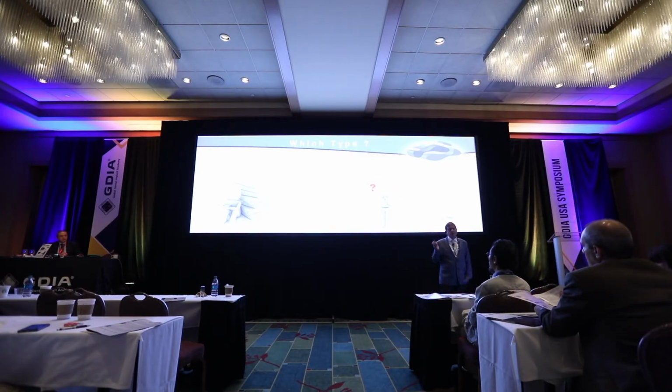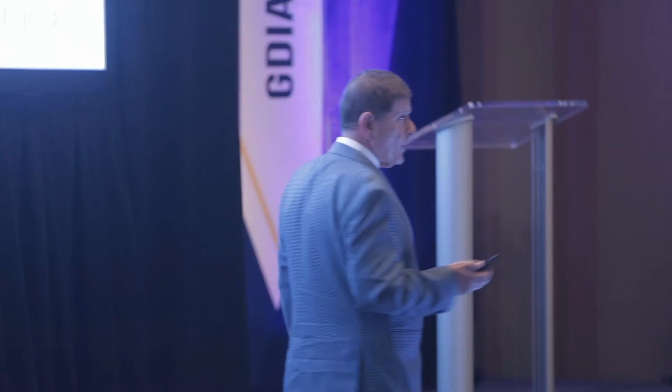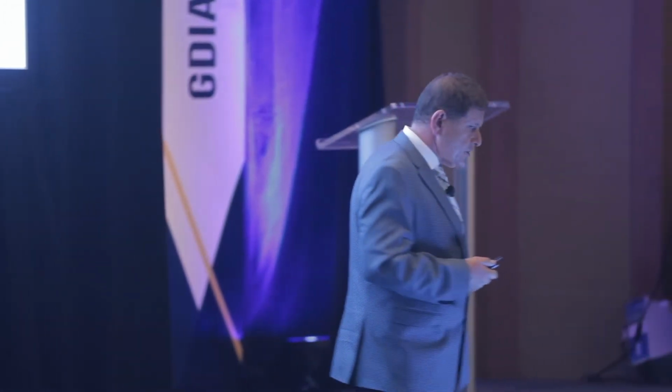For our field, calcium phosphate is not so suitable. We have different requirements. So the only one left was calcium sulfate cement. How many of you are familiar with calcium sulfate? Please raise your hand. Very few. But it's not true. All of us know what calcium sulfate is. It's the plaster of Paris.